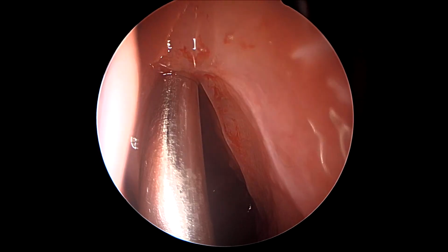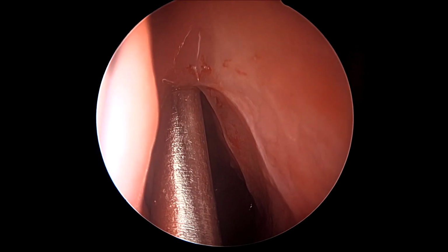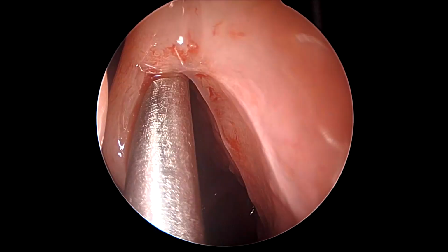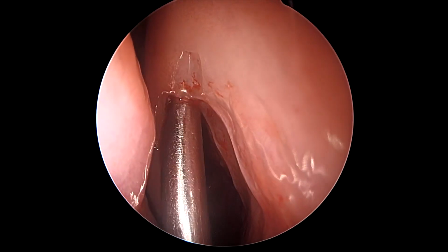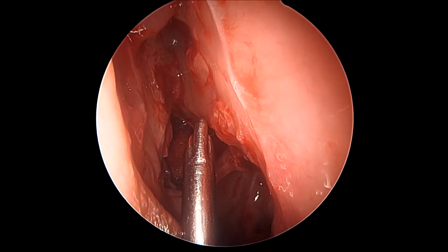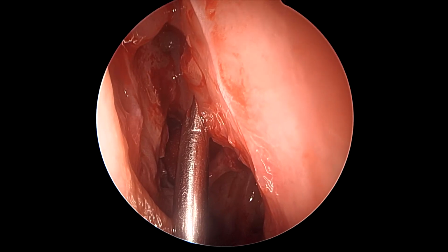Here we are using a straight suction navigator, an angled frontal sinus suction navigator, to make our way inside the frontal recess, though not the frontal sinus itself right now, because as we had seen, the anatomy of the frontal sinus is slightly distorted here by the presence of both a T2 or a T3 cell, a Kuhn cell anteriorly, as well as the presence of a large frontal bulla cell that rides nearly over it, thus restricting the frontal sinus opening.